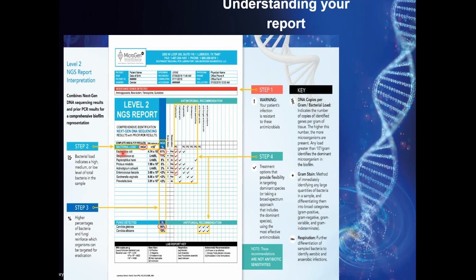So you may be culturing staph for a penile implant, but that'll be a very low load, as we're going to see in a later example. But another bacteria is actually what's causing the infection. So look at bacterial load, or what I call abundance. You can also have fungus. 15% of penile implant infections now we think are fungus related, not bacteria related.